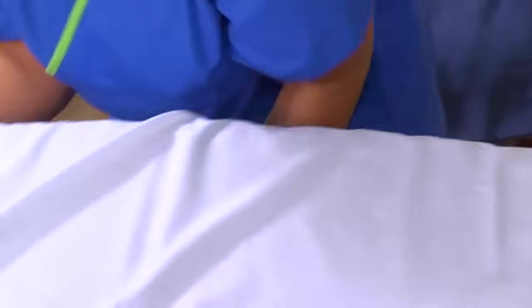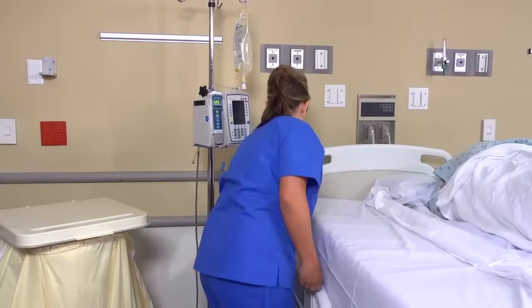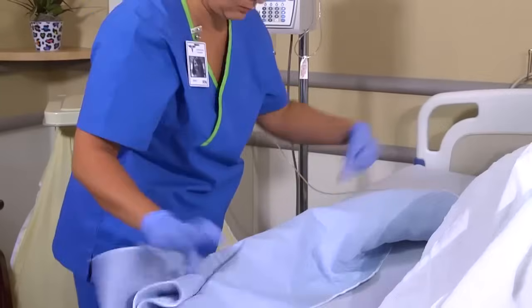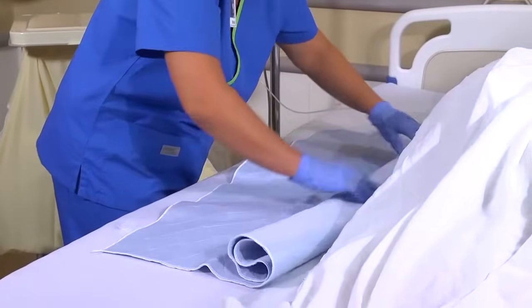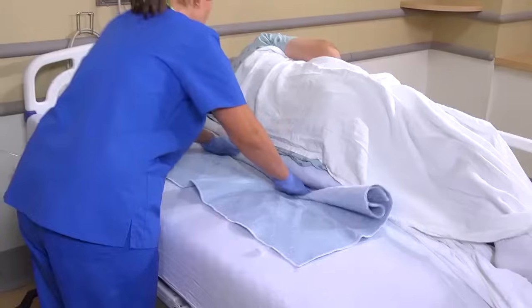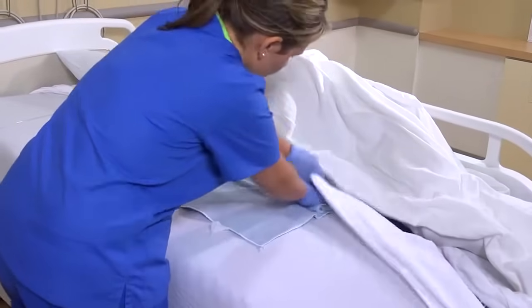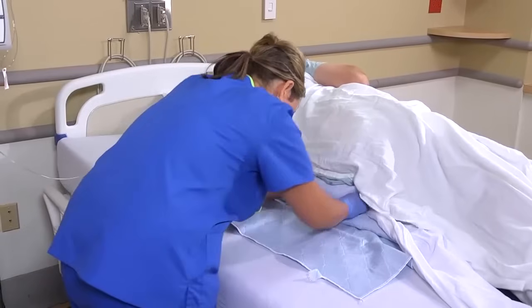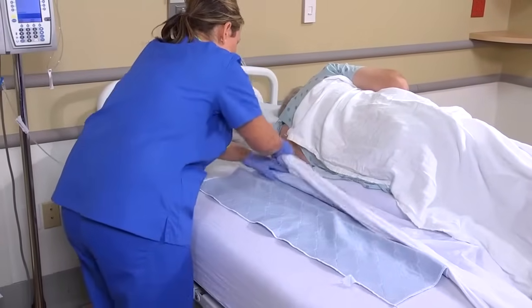Then tuck the remaining portion of the sheet under the mattress, moving toward the foot of the bed and keeping the linen smooth as you go. Place the draw sheet, or waterproof pad, lengthwise along the middle of the bed, and tuck the remainder under the patient's torso and buttocks. The pad should be fan-folded or rolled on top of the bottom sheet. Keep the linen beneath the patient as flat as possible, because he'll have to roll over these layers when you're ready to make the other side of the bed.